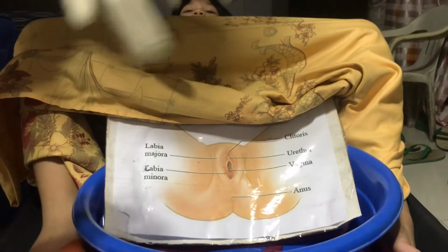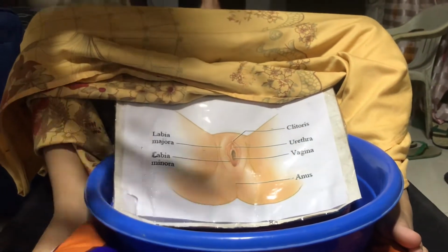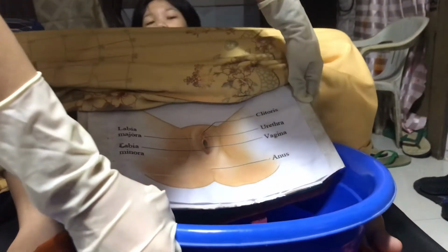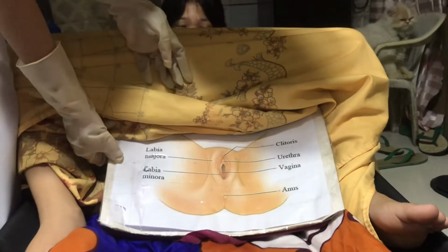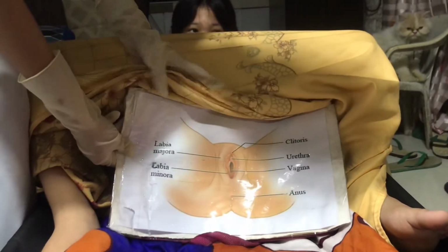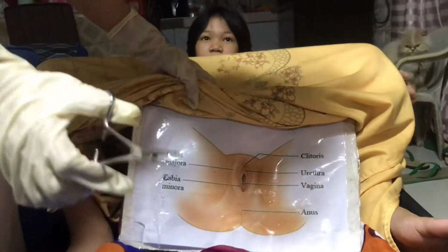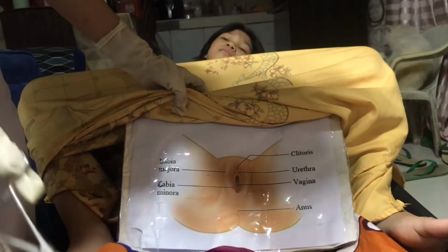Since we already dried the perineal area, we need to remove the bedpan gently and turn the patient to the side. To dry, if necessary, take one cotton ball and cleanse one side of the buttocks, then clean the other side of the buttocks and dry both buttocks.